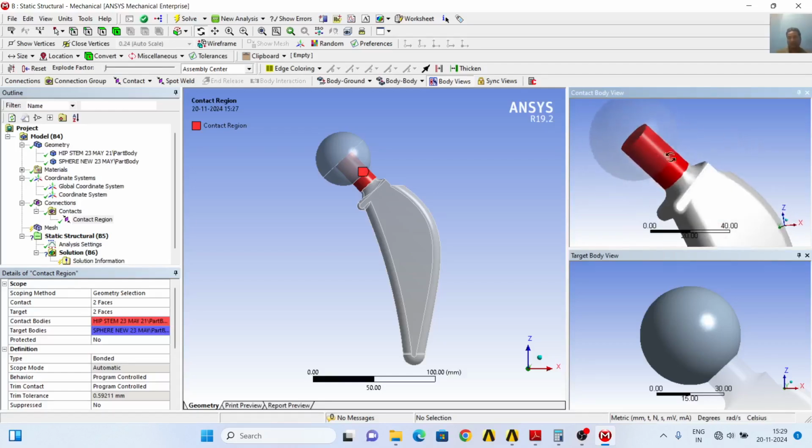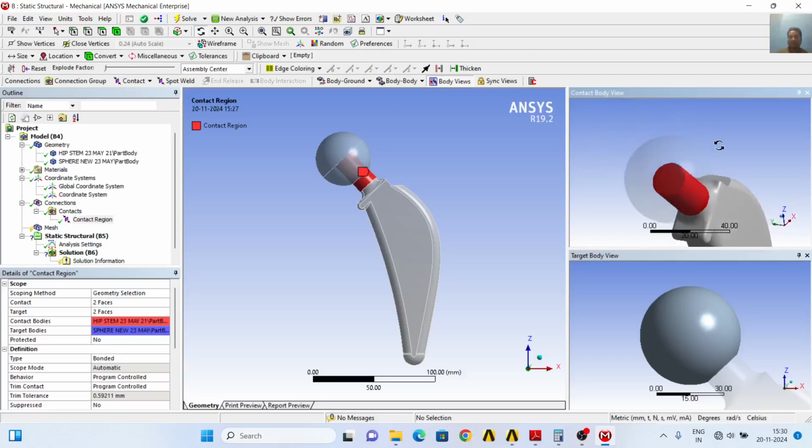And for this portion, you will multiply pi d into this length of the neck. So the length into the pi d will give you the area of this cross body, and the upper area you will know by just using the formula pi r square.